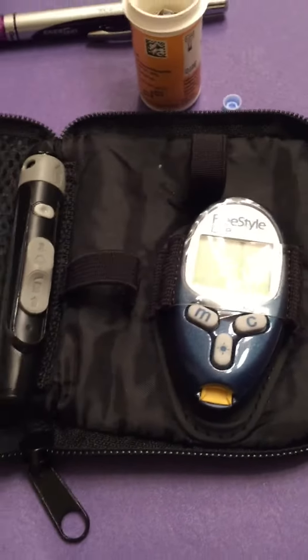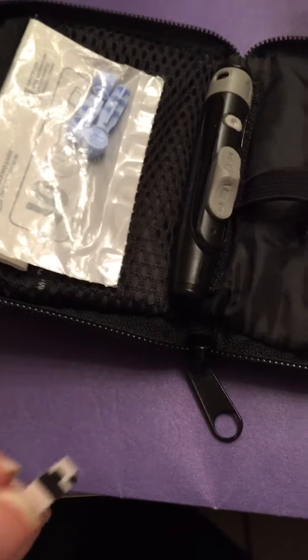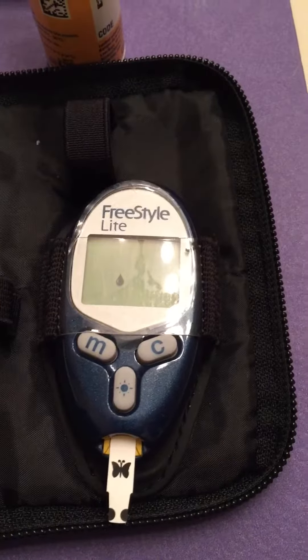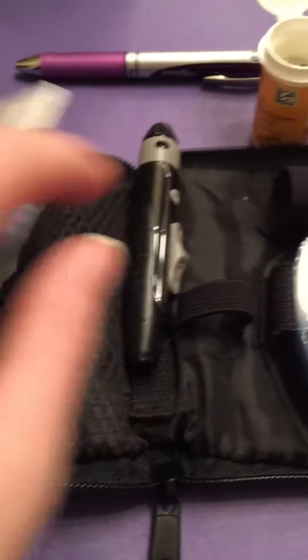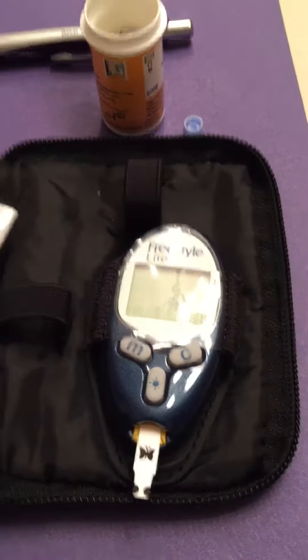In order to test my sugar, I have to insert a strip like this into the monitor. I go ahead and do that, and then it shows a little blood drop. I already have a needle inside my applicator, so I put one of these inside of here, and I pull it down and stick my finger.